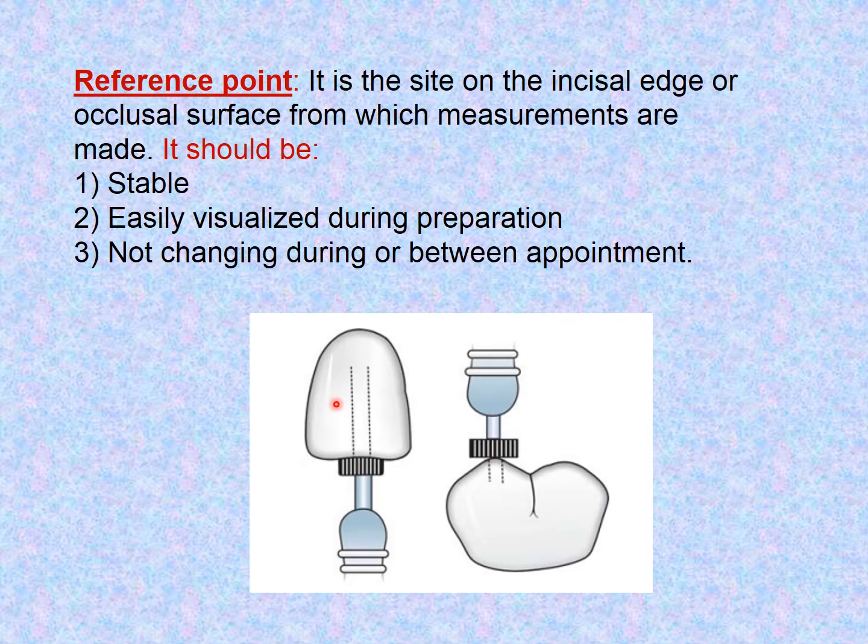يعني ما يصير انه يصير بيها، ما ممكن انه يصير بيها fractures. فاذا صار fracture بالتوث مثلا من هالطريقة هنا من هالسايد، ايش حيصير عندنا؟ حيتغير ال working length.